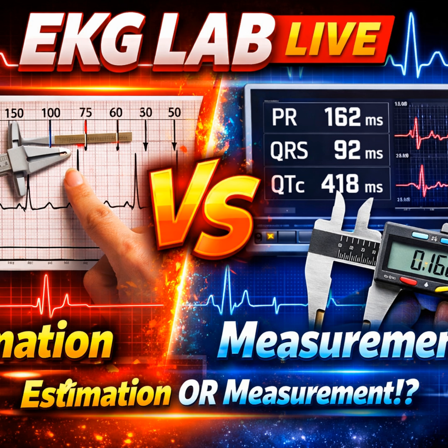And yet, if that nurse mistakes fine VFib for asystole because they didn't look closely at the gain or the amplitude, essentially measuring the voltage, they might cease resuscitation on a viable patient. Or if they mistake artifact, like a toothbrushing patient, for VTach, and shock a conscious person. A toothbrushing patient. It happens. Vigorous toothbrushing creates an oscillatory artifact that looks exactly like VTach. If you don't look at the patient, if you don't use context, you are going to defibrillate someone for dental hygiene. Which brings us right back to the necessity of verification.